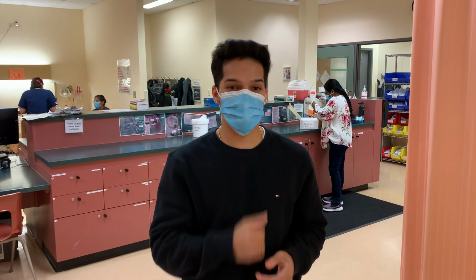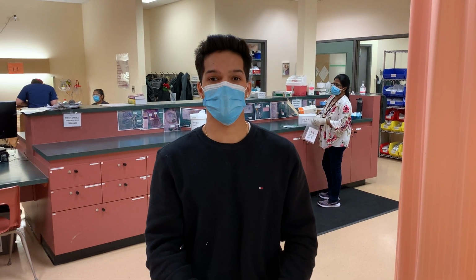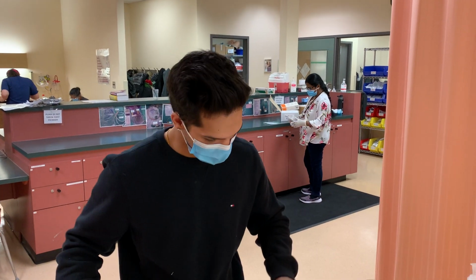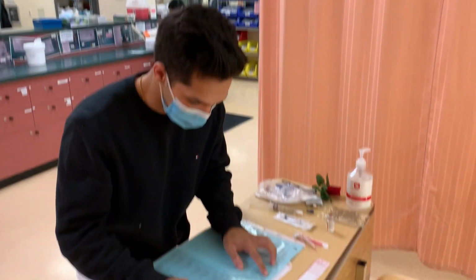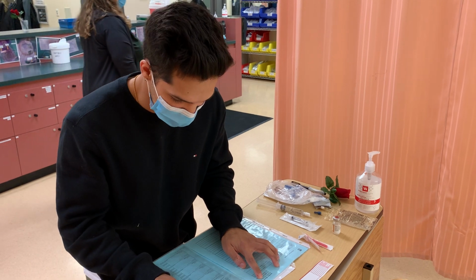Today I'll be demonstrating how to set up and administer continuous infusion of insulin. So the first thing I'll be doing is looking at the physician's orders and comparing them to the MAR. And over here we have orders for Scotland Bryson. FIN is 123, 123, 456, 456, 79, 79.